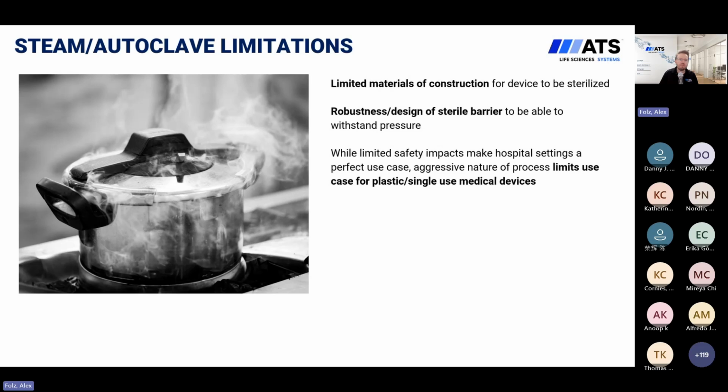So again, coming back to the advantages, limited safety impacts make hospital settings a good use case, right? Cleaning off those surgical tools, but again, limited use cases for plastic and single-use medical devices.